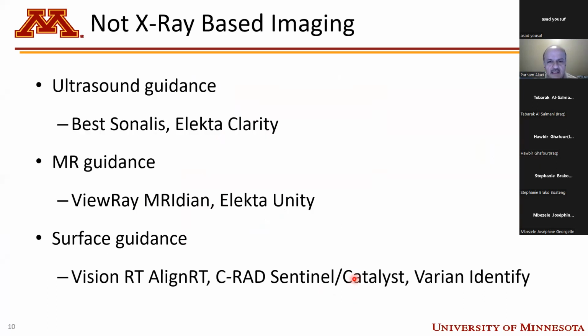And then, non-X-ray based imaging. The focus of the talk is on the X-ray based ones, but there are quite a few of them out there. Ultrasound guidance, MR guidance, you're very well aware of those, and those are the ones that are used mostly for adaptation, for adaptive planning, and they can account for the intrafraction motion very well.